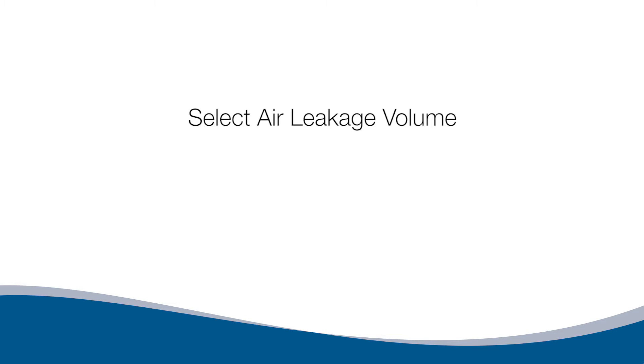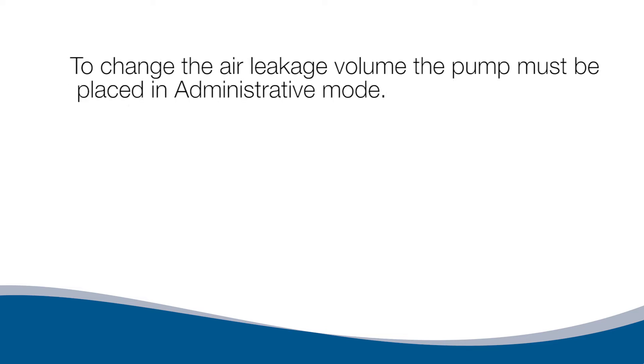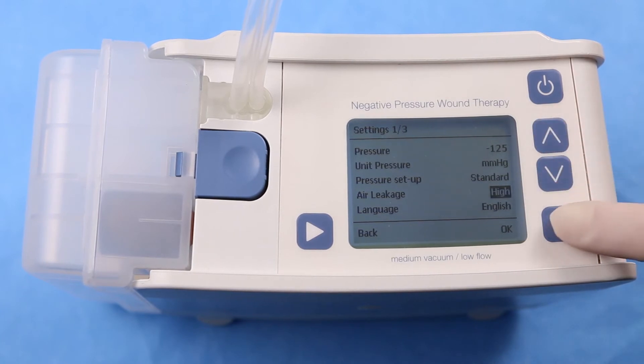Select Air Leakage Volume. Standard and High air leakage volume settings are available. The default is Standard. In Standard Mode, the air leakage alarm will go off within two minutes. In High Air Leakage Mode, there will be no leakage alarm during the first five minutes, allowing the set pressure to be established on a wound with high volume without an alarm. High air leakage volume mode is available for wounds with air leakage between 1500 and 2200 milliliters per minute. To change the air leakage volume, enter Administrative Mode by pressing and holding the bottom left button and pressing the top right button, then press the left and right buttons at the same time. Select Standard or High using the up or down arrows, then press OK to confirm.